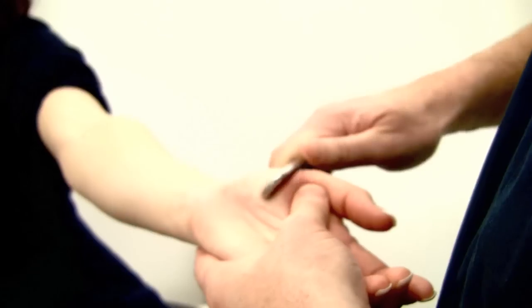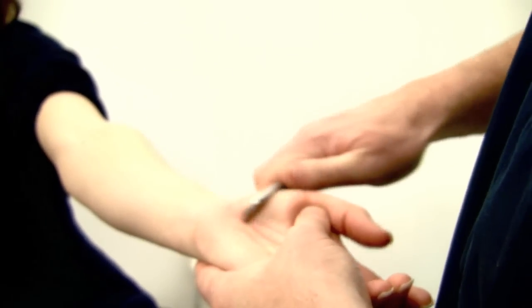For the wrist, we did a number of treatment therapies. We utilized chiropractic manipulation to the joints. We used Graston Technique to help break up some of the tissues. We used electric stim with heat to warm them up before we do the Graston. We also use something called kinesio tape. Kinesio tape is great in that it helps with function, restoration of normal activity within the tissues themselves, and lymphatic drainage, which is great. Combination therapy for any type of tissue malfunction.